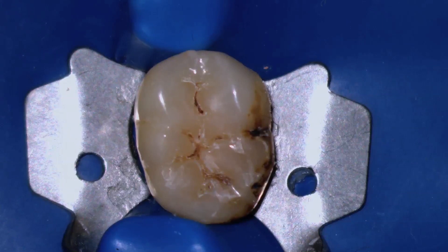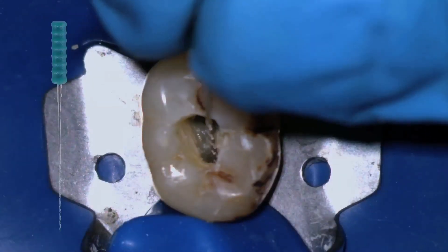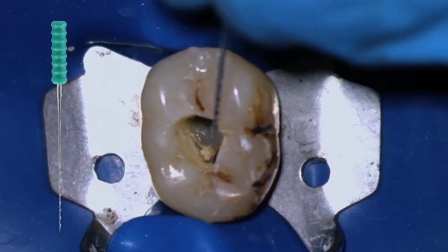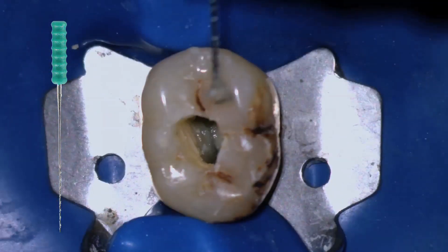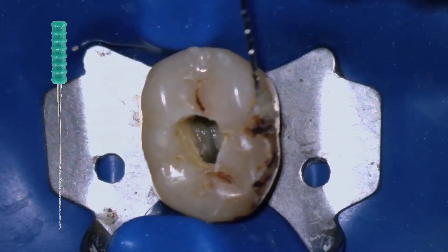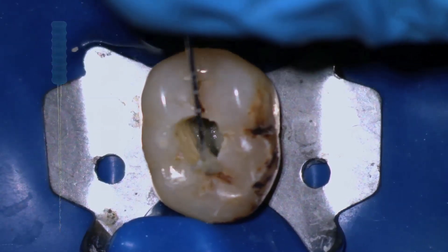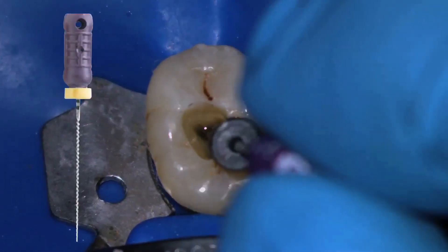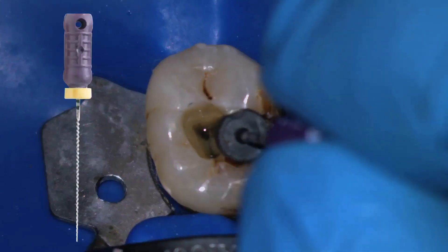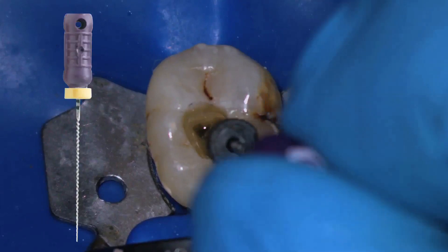Now we are going to see this lower molar done with WaveOne Gold. Here we have the tooth that has been determined to require root canal therapy and is restorable. We do the access opening. After access opening, we remove the contents of the pulp chamber. We ascertain that the canals are patent with a very small file. You can see the fluids in the very flooded pulp chamber.